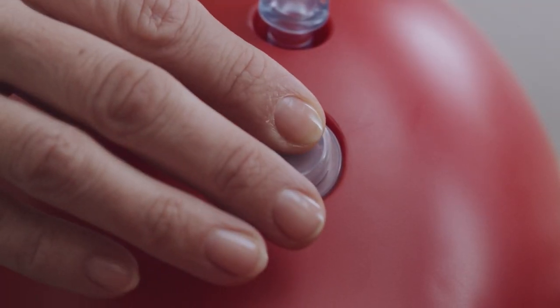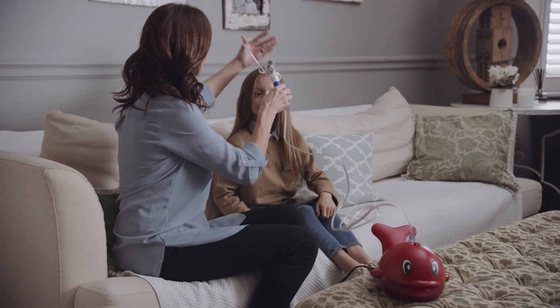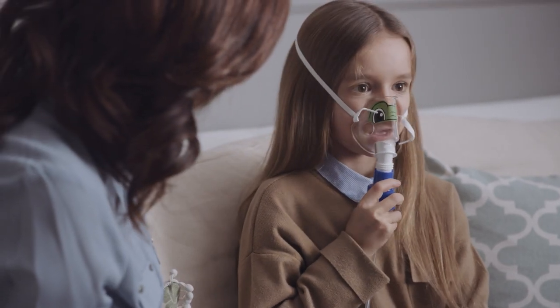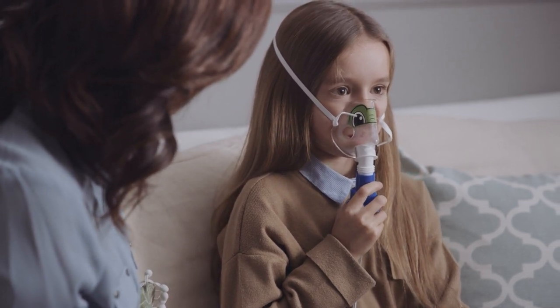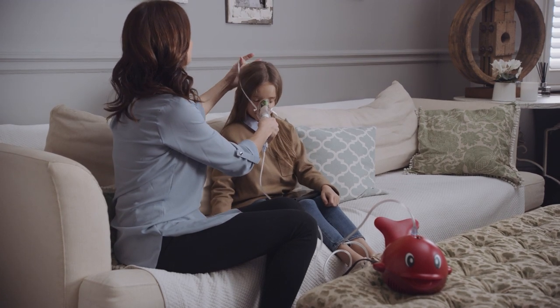To take the treatment, ensure the user is seated in a relaxed upright position and switch on the unit. Make sure mist is visibly coming from the mouthpiece or mask. If using a mask, place it securely in position over the nose and mouth and breathe slowly in and out through the mouth. When the Sidestream begins to work intermittently and sputters, the treatment is finished.